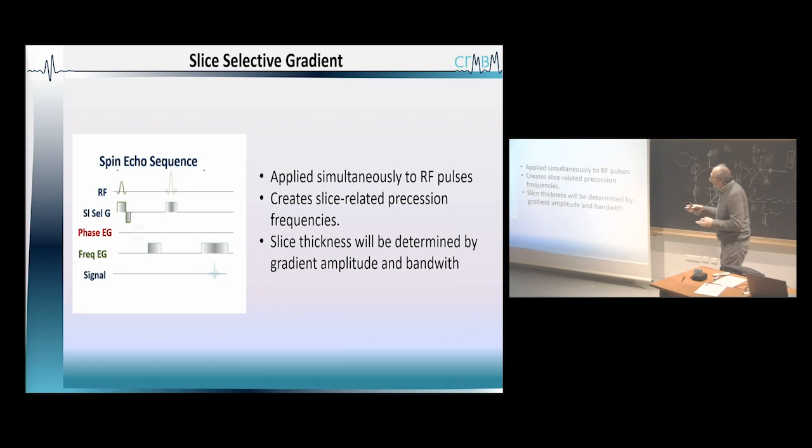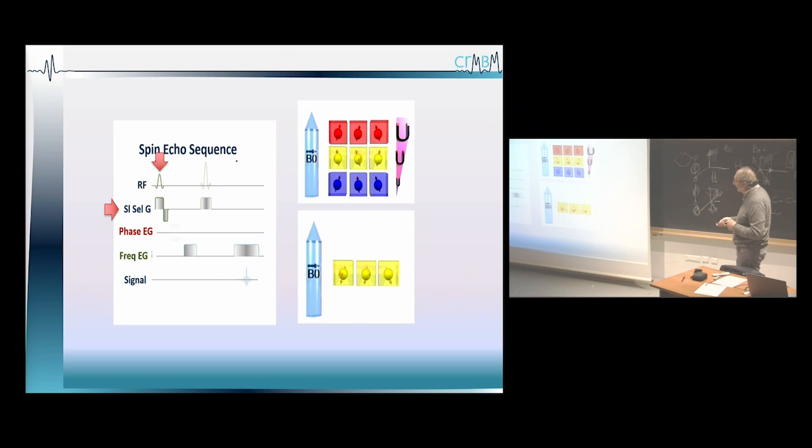So the idea is that you are going to apply this structure of different pulses and gradients so that you can cover the entire region of interest. Basically, if we go gradient by gradient, very simply, the very first one is a slice selective gradient. Imagine we've got a 3D volume. We want to excite just one slice only, not all the brain, but just near the nose, for instance. So you use the gradient.